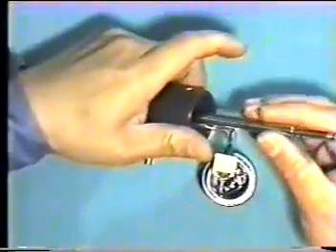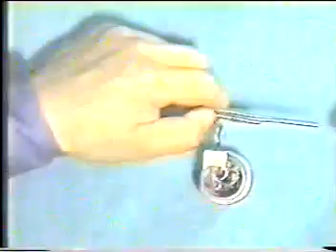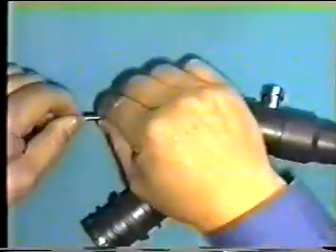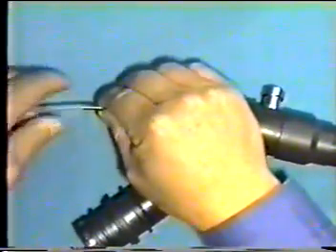Loosen the two set screws and remove the guide. Make sure the guide can be extracted smoothly. How to remove the LG light guide. Connect the guide tube as a jig to the light guide.